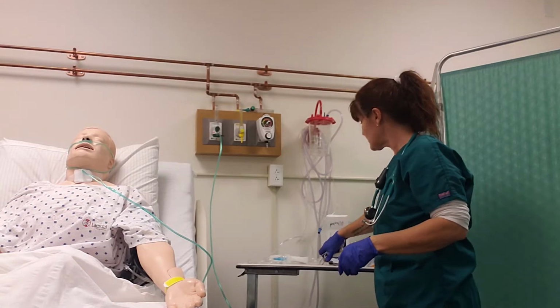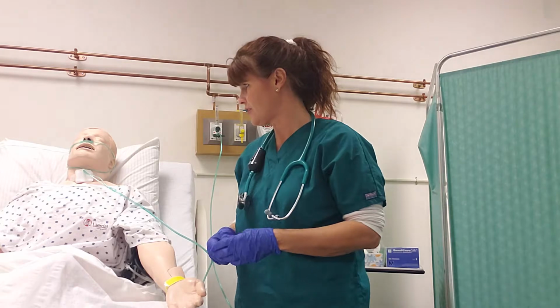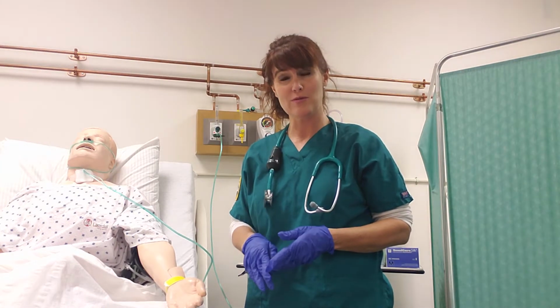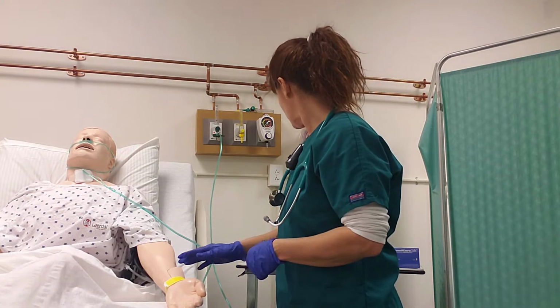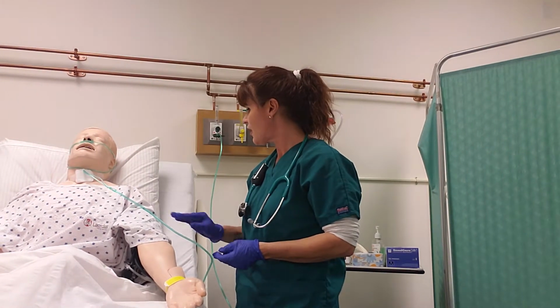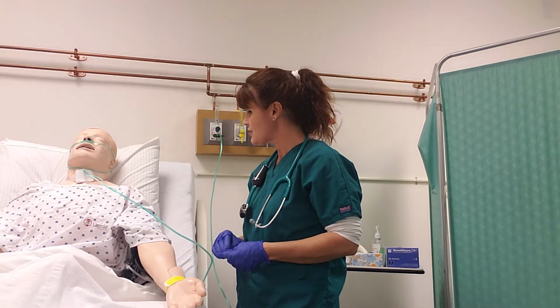Now we'd also listen to the patient's breath sounds again, in the same way that I demonstrated the first time. Everything seems to be improving. We have no trouble. So I'm going to talk with Mr. Wilson, let him know that I'm going to come back here and check on your oxygen in about 20 minutes. Okay, I'll put some things in your chart.